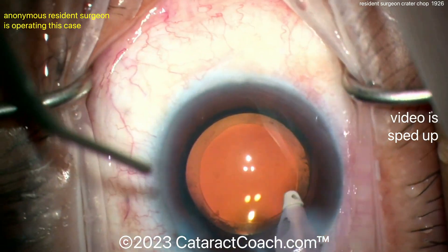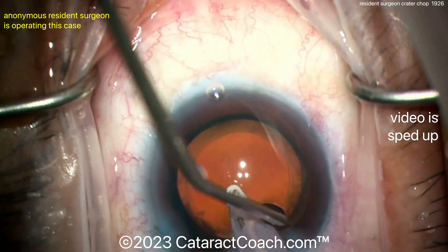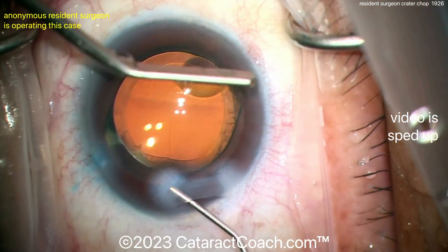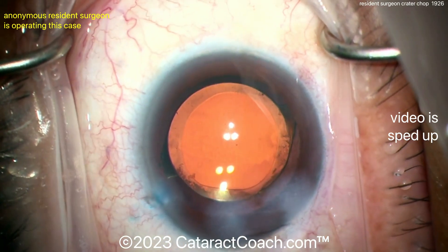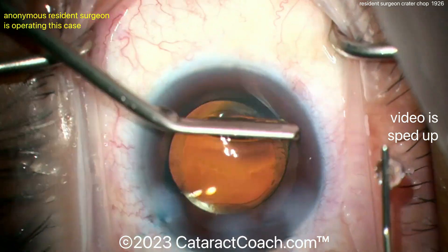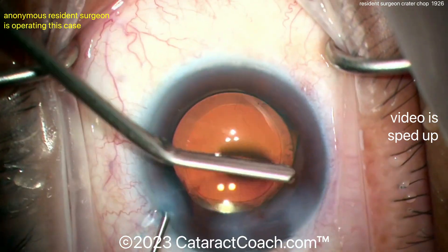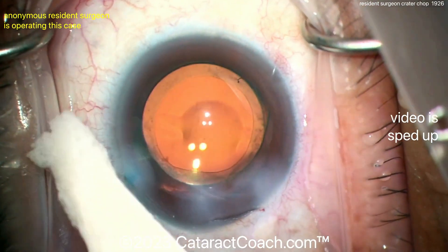With irrigation and no time constraint, you can take your time, place the chopper around the lens equator, and get that beautiful horizontal chop. At the end of the case here — nice looking incision, nice looking rhexis. That's a beautiful surgical signature. For case 100, young Jedi, I am very proud of you and I'm sure your attending is too. Keep up the good work — learn to do phaco chop, and if you have trouble, try the crater chop.